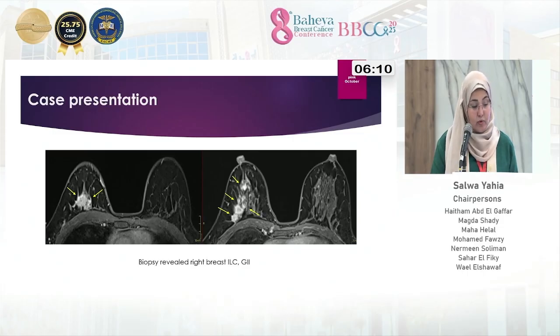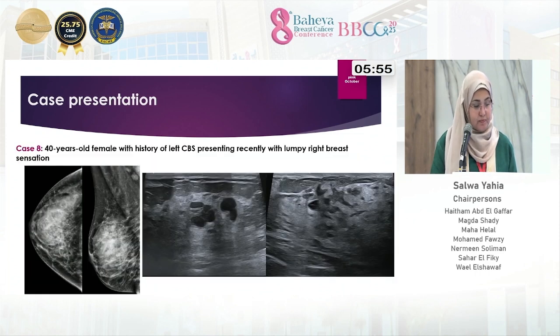Dynamic MRI showing right breast deeply seated, irregular shaped, heterogeneously enhancing mass lesion associated with anterior segmental area of heterogeneous non-mass enhancement. Biopsy revealed right breast invasive lobular carcinoma grade 2.